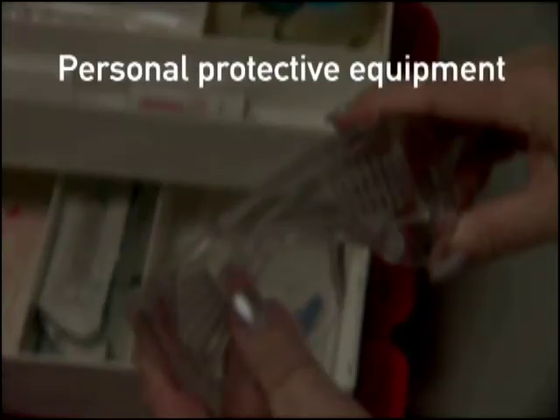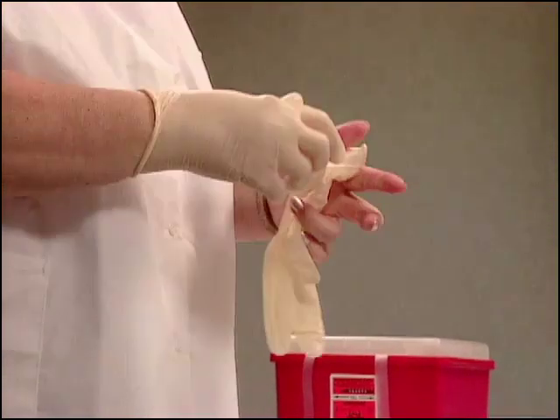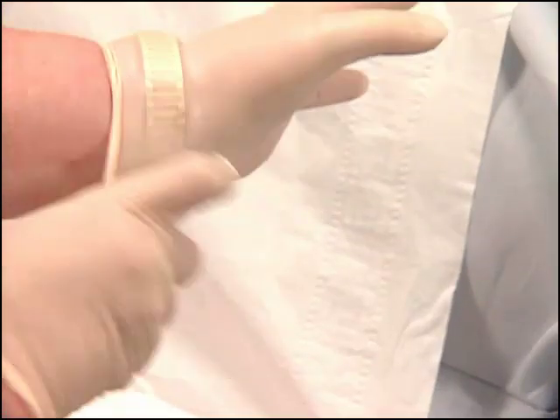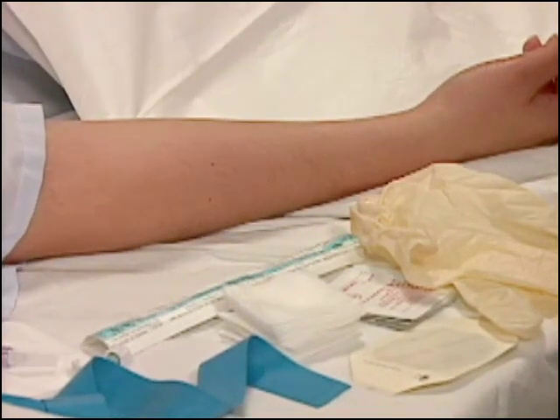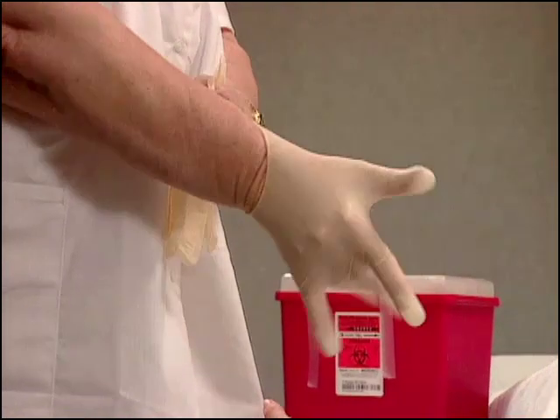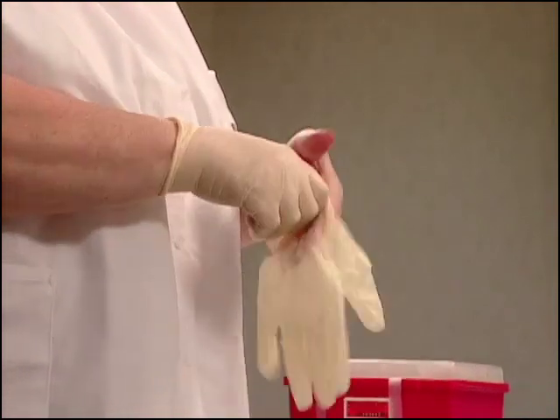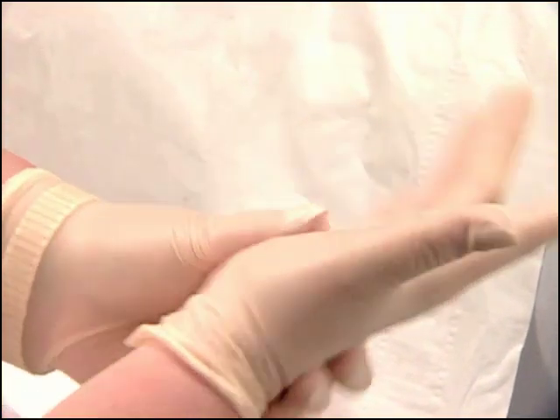Personal protective equipment such as gloves, goggles, masks, and gowns should be chosen on a case-by-case basis. Although gloves are always worn, masks and gowns may be optional in certain situations. When you are fully prepared with all the appropriate equipment, return to the patient in order to complete the procedure. Don your gloves, make sure they fit snugly, and inspect them for tears and holes. Never tear off or remove any part of the gloves while you are wearing them.